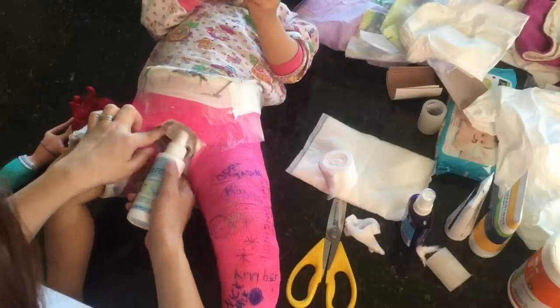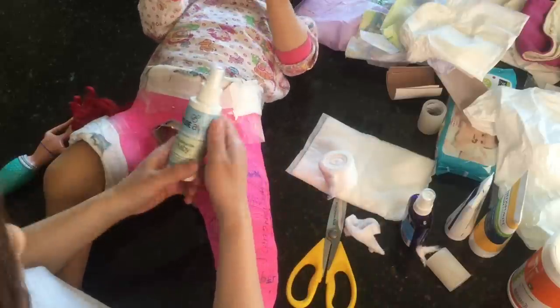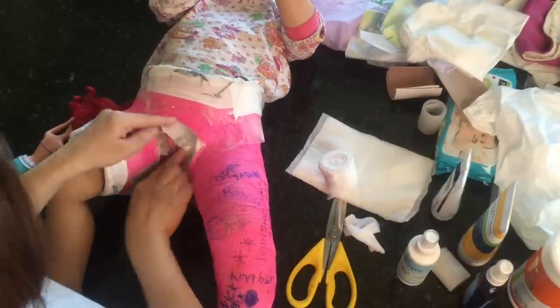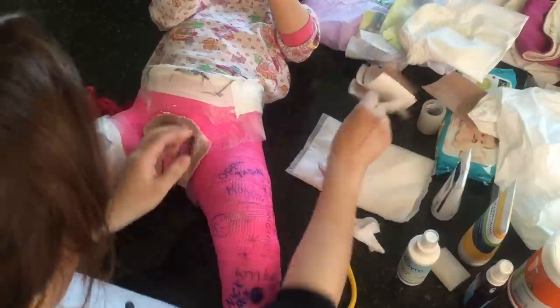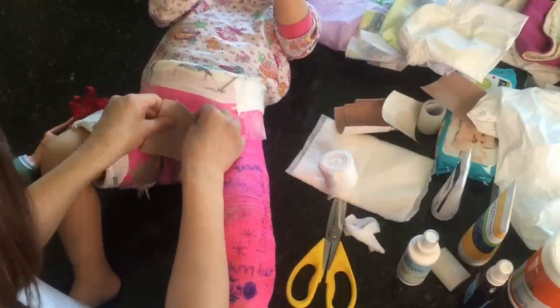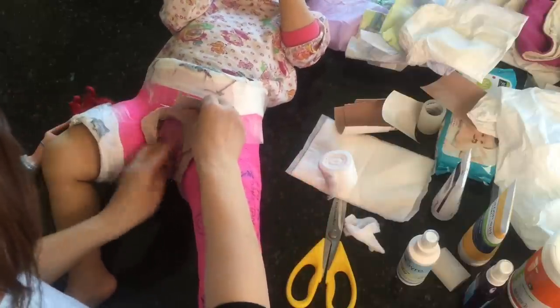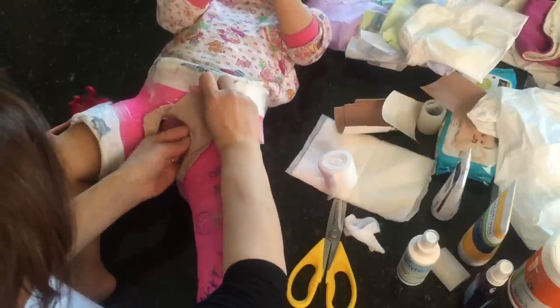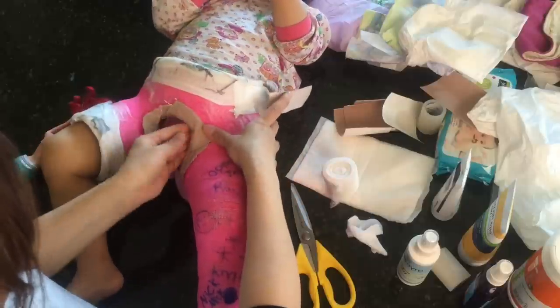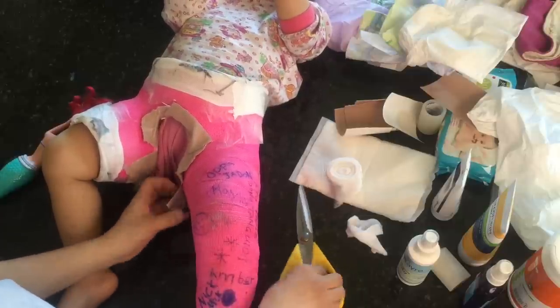I got most of my supplies from Diaper.com. After drying, I covered and taped it up. The hospital gave me little band-aid strips that you can cut and wrap around the cast edges — sometimes it's sharp so the baby might be uncomfortable. The diaper goes in there so it doesn't have to be perfectly smooth. You can construct it any way you want.